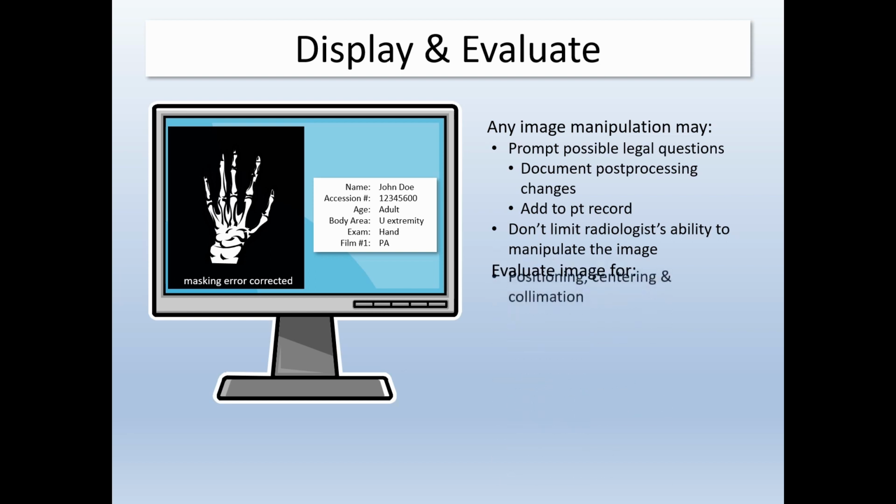Use a critical eye when evaluating an image. Is positioning, centering, and collimation adequate? Finally, look at the exposure index number. Is it within the desired range? If not, take notes to correct the problem in future examinations.